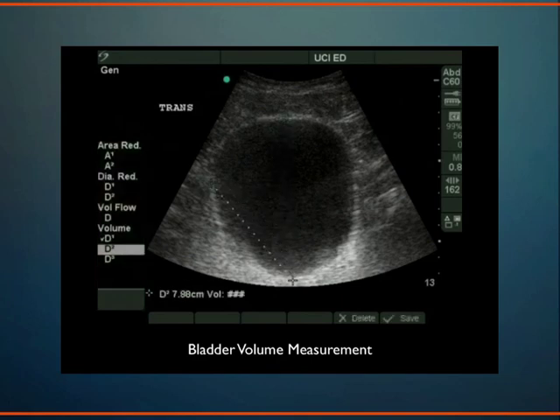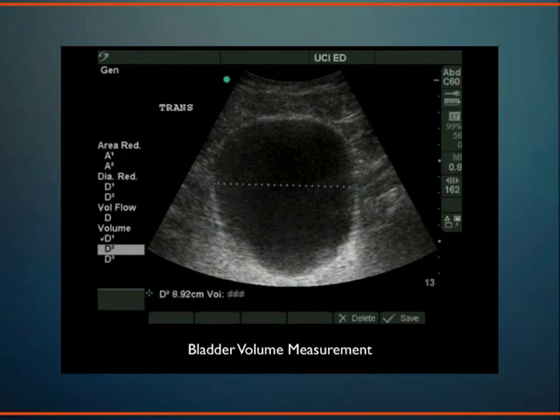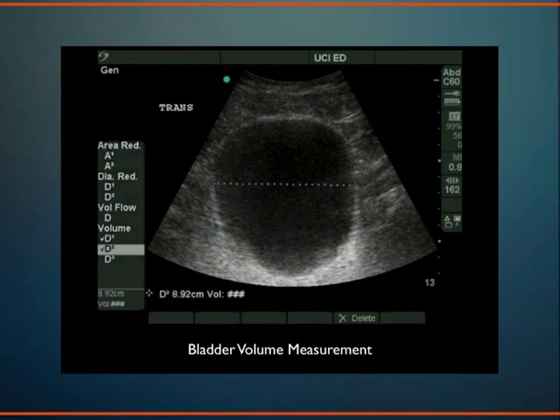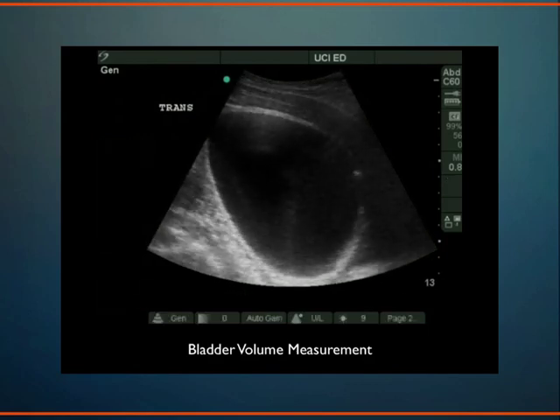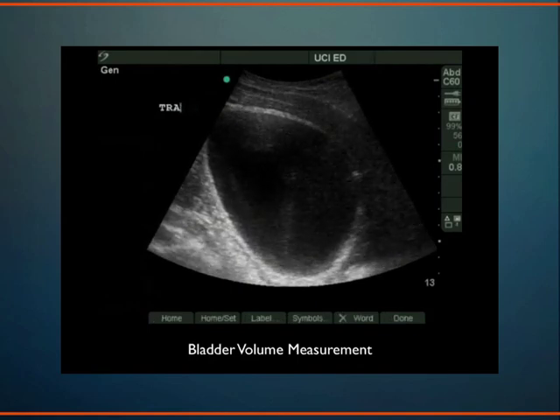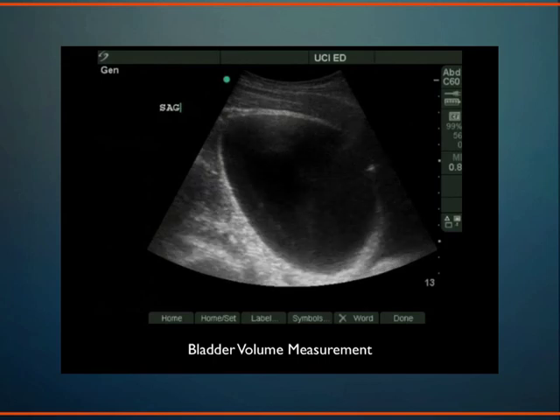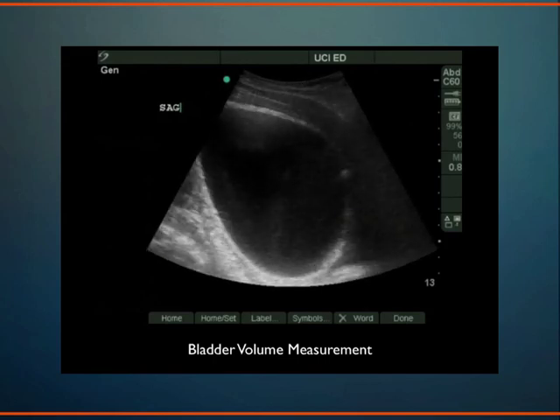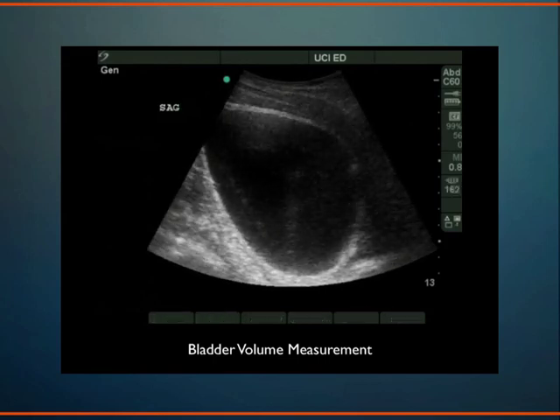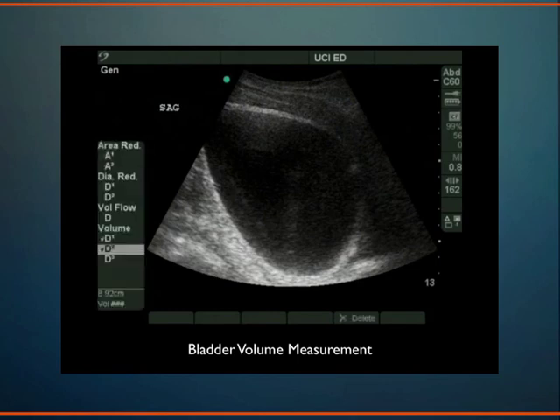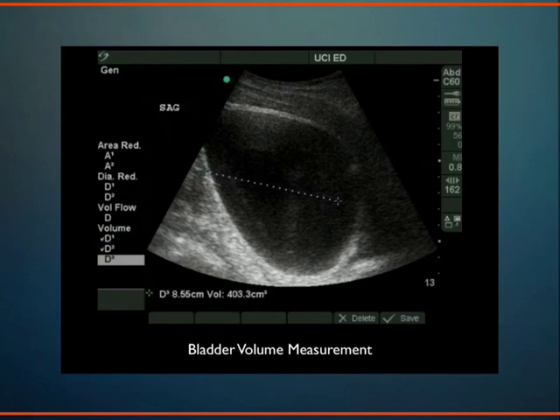D1 is entered as height, D2 as width. Then we unfreeze the machine, move the probe into a sagittal plane, and get the length of the bladder. Those are the three dimensions — height, width, and length. You can enter these into some machines, or multiply the values to estimate the bladder volume.